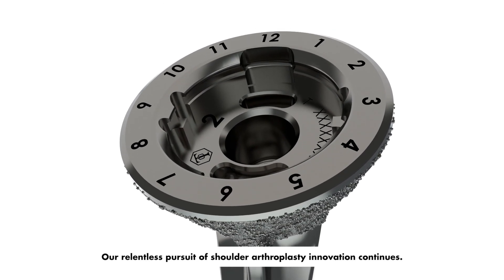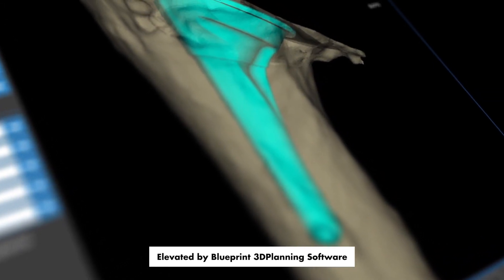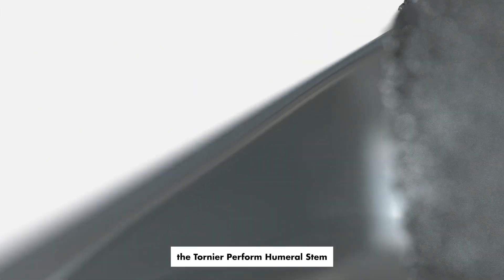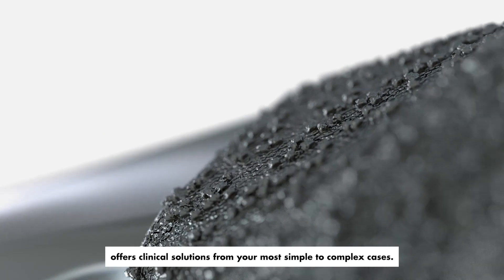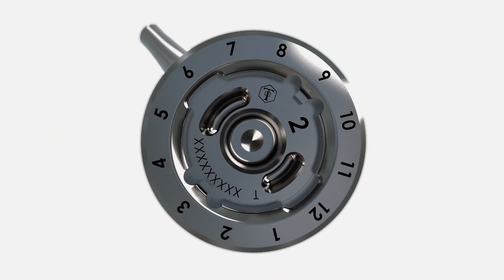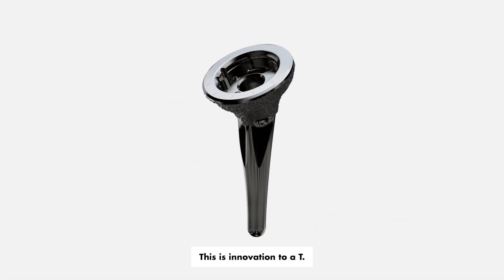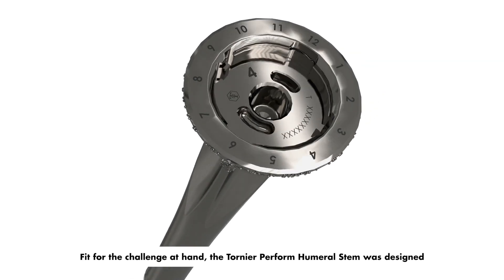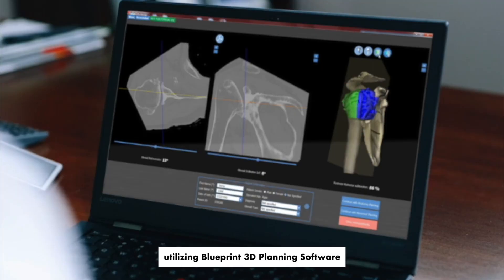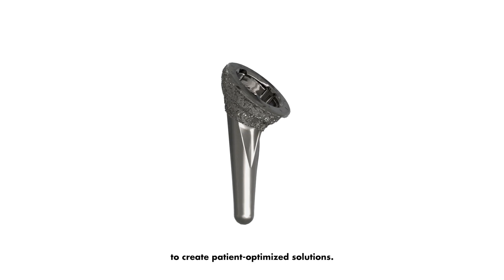Our relentless pursuit of shoulder arthroplasty innovation continues, elevated by Blueprint 3D planning software and the market-leading Perform anatomic and reverse glenoid. The Tornier Perform humoral stem offers clinical solutions from your most simple to complex cases — refined, reproducible, ready for anything. This is innovation to a tee, fit for the challenge at hand. The Tornier Perform humoral stem was designed utilizing Blueprint 3D planning software and real-world clinical experience in shoulder arthroplasty to create patient-optimized solutions.